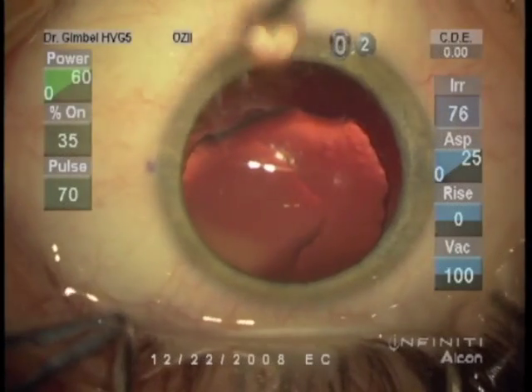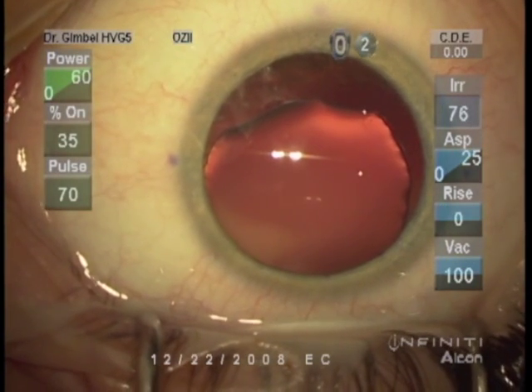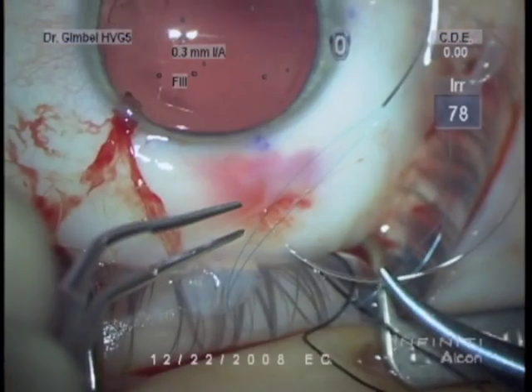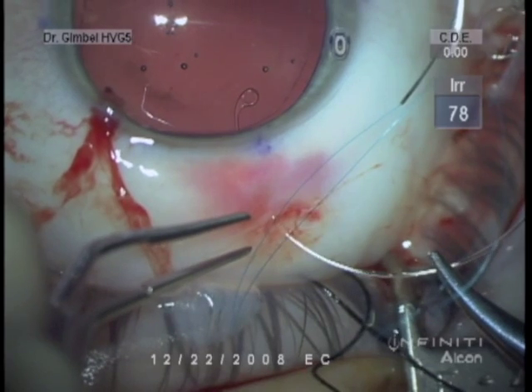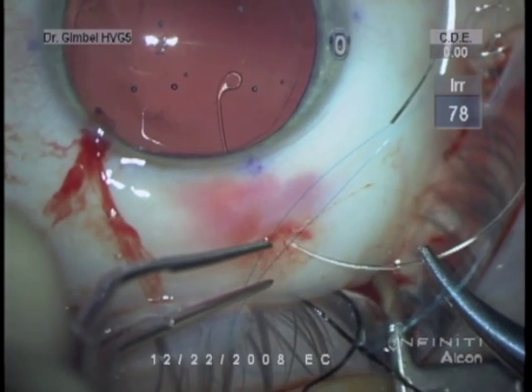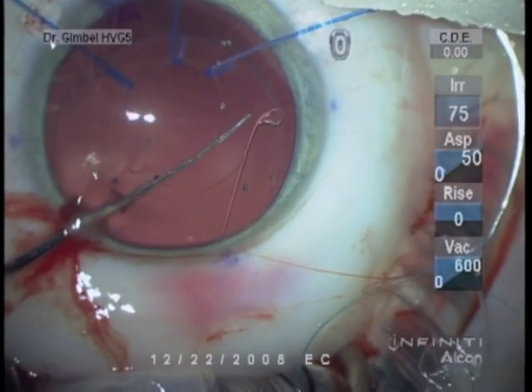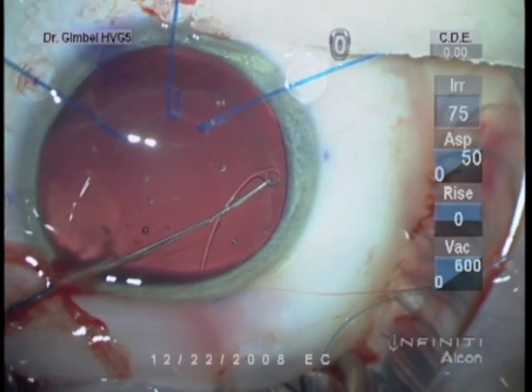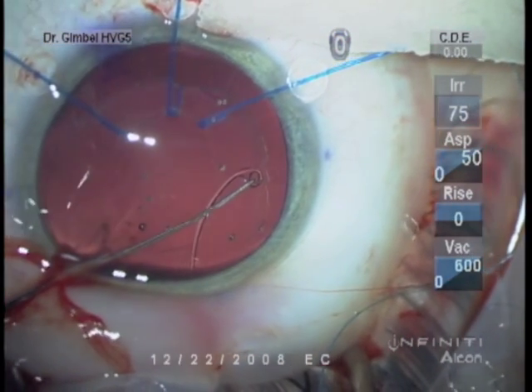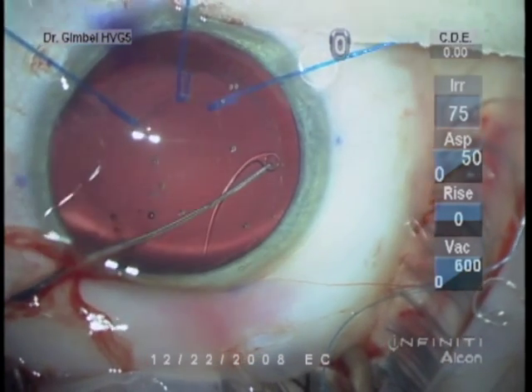I'd like to discuss the implantation of a capsular tension ring, or Sioni ring, using a Sinski hook. In special circumstances like this — this was a Marfan's case back in 2008 with a very loose zonule situation — it is difficult to place a Sioni ring when the capsule is so loose, because of the way that the initial tip would engage the peripheral capsule.